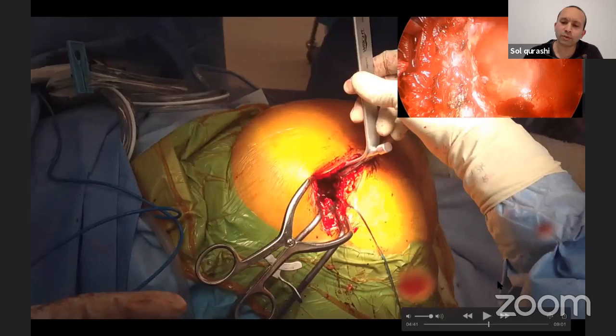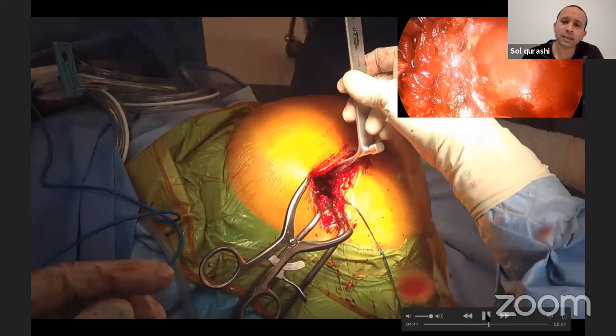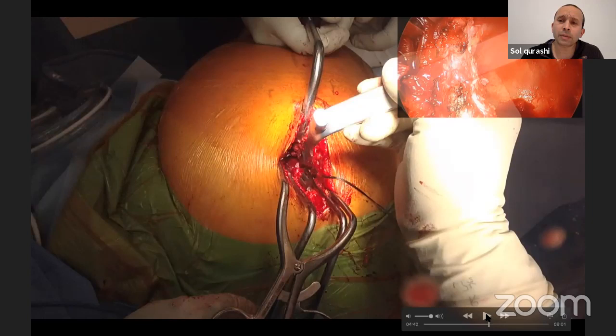But I usually expose a little bit of the posterior superior wall to give me an idea to make sure that I haven't reamed it out, or how thick it is, or how thin it is, to allow me to preserve it. The other thing it does is that if when you're impacting the cup, you get a little slit in it or something. I'm sure I've cracked a lot of acetabulae in the posterior approach that I used to do, but here I will know about it. And if I know about it, at least I can modify their weight-bearing status, etc. Because unlike posterior approach, we get them up weight-bearing as tolerated 2-3 hours later.